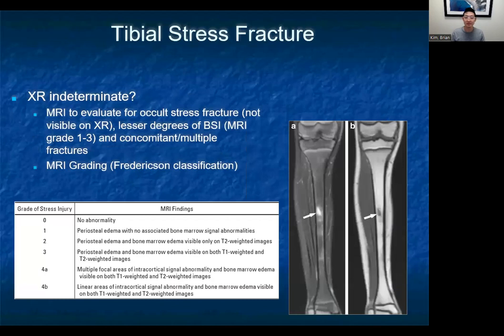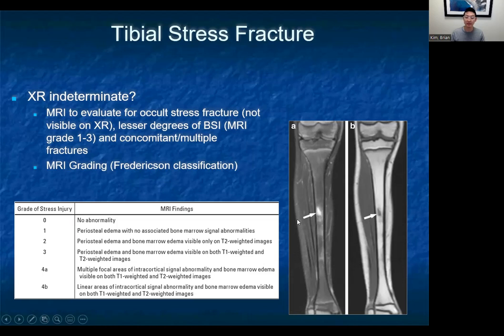If the x-ray is indeterminate and you still have increased clinical suspicion, MRI is generally the next step. It not only shows complete stress fractures — grade 4 — but can show lesser grades 1 through 3. The Fredrickson classification is a commonly used grading system, and images on T1 and T2 fluid-sensitive sequences can demonstrate bone marrow edema consistent with a bone stress injury.